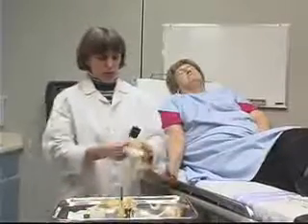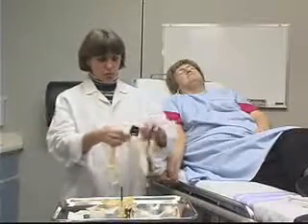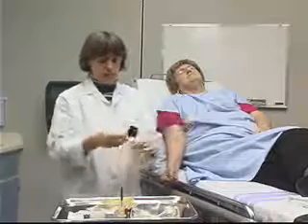As with all procedures we're going to use universal precautions, and for this procedure they include protective gloves and protective eyewear.